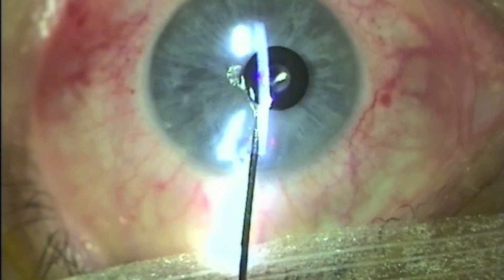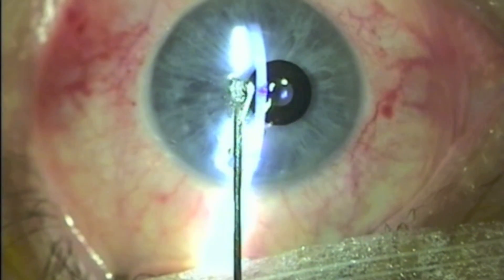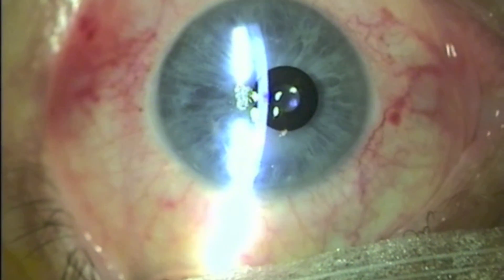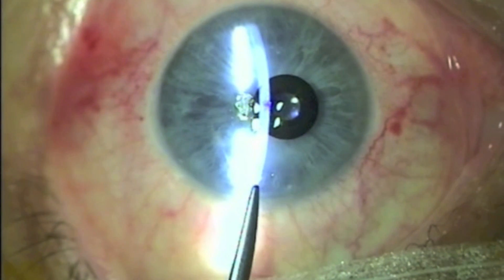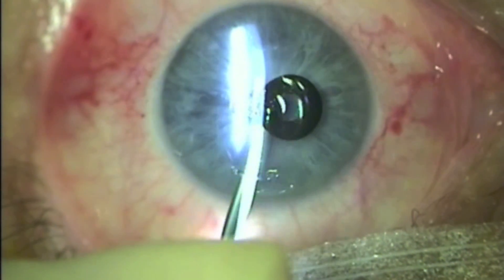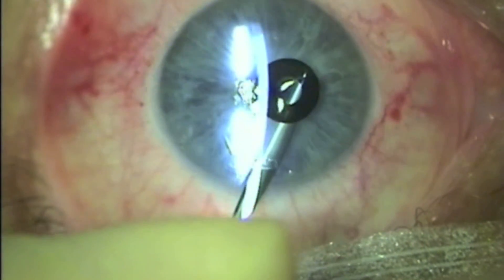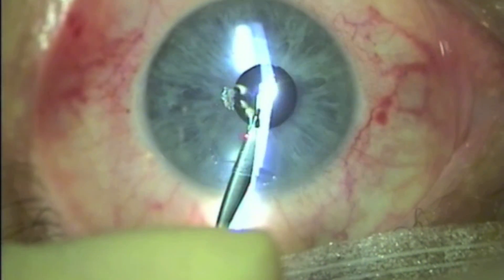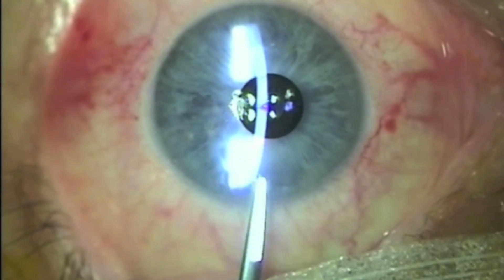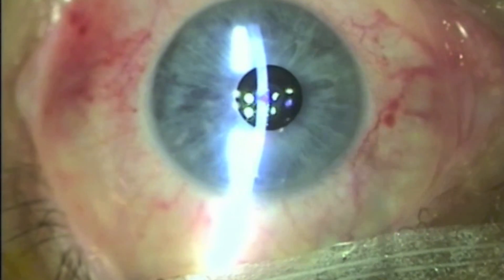However, one can see that the inlay is still placed too nasally with respect to the corneal mark. The same cannula is now going to be used to gently move the inlay to the desired position — we are just positioning it in the little pocket. Finally, the slit lamp is used to verify that the inlay is perfectly positioned.